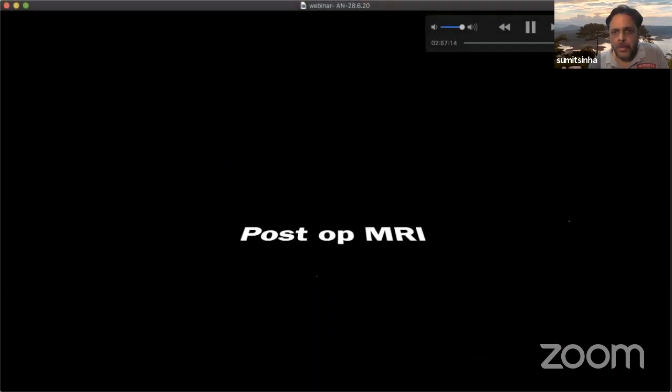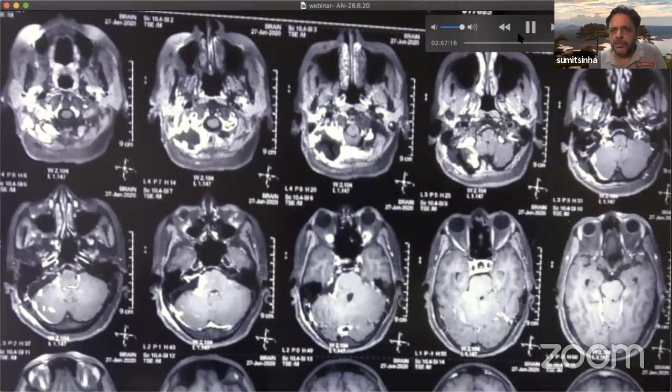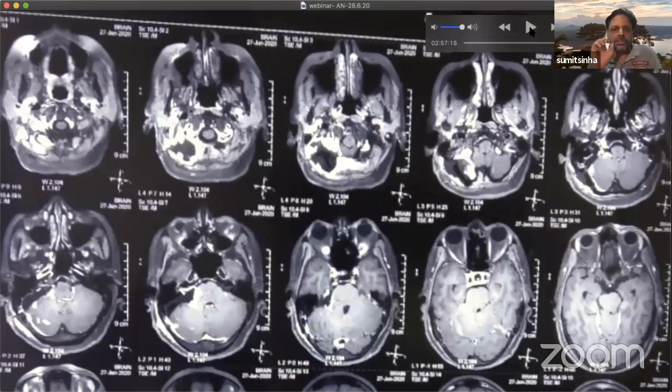So this is the post-op MRI. Now, this post-op MRI somehow could not be done immediately post-op. Normally, I do immediate post-op MRIs, but in this patient, this was done 1 week after the surgery. Now, let me tell you, this is not a good time to do a post-op MRI, because you will see some blood there, like the case I'm seeing here. There is no residual tumor, but there is blood over here, which comes in after 48 hours.